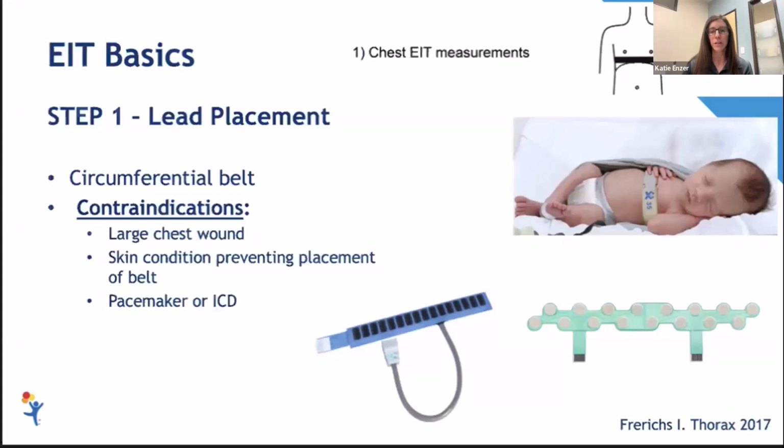Here are some pictures of commercially available EIT belts you may see for infants or small children. Prior studies have shown that performing EIT in preterm infants, even in the newborn period, when their skin is exquisitely delicate, is safe and well tolerated. In fact, it can be left on for several hours, which is one of the greatest strengths of EIT.